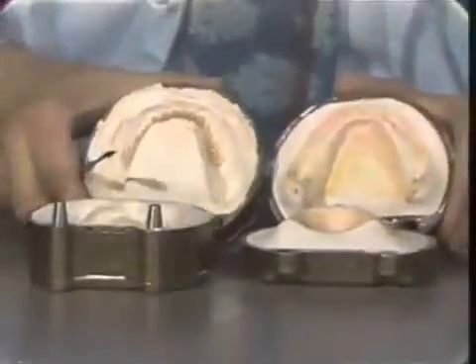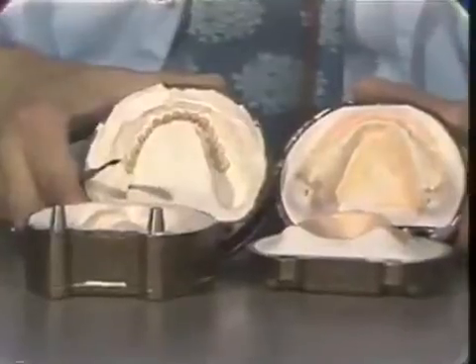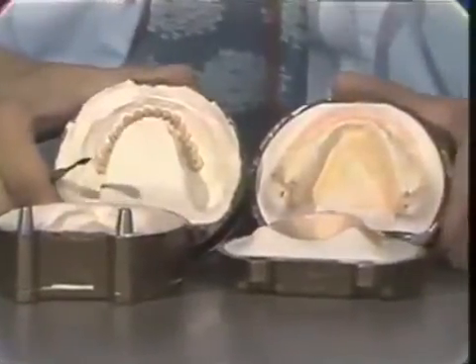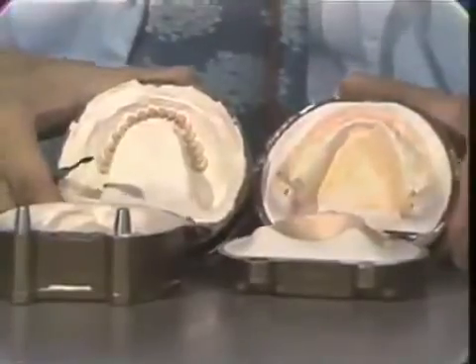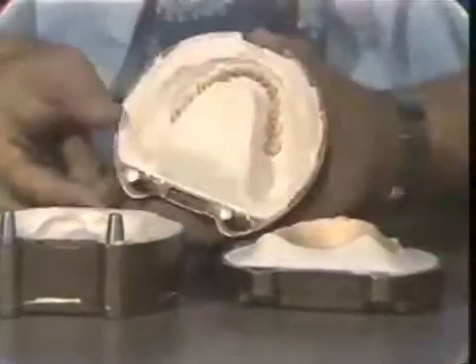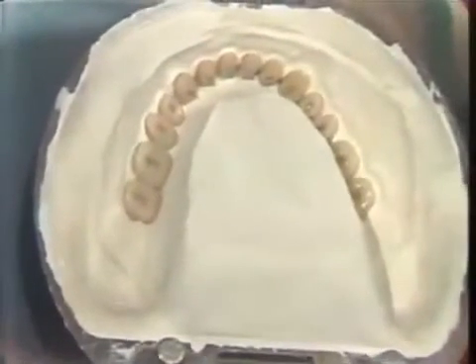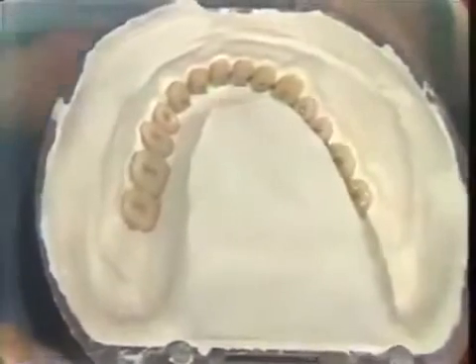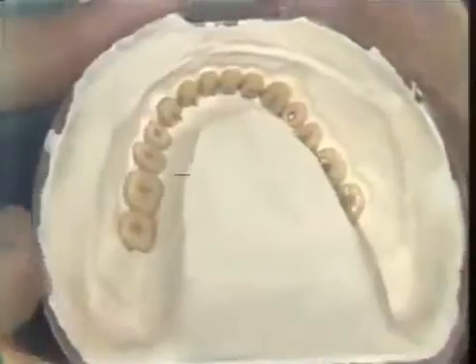Now you may see the mandibular flask. The master cast does not look any different than it did when you originally poured it. It has all the exact contours that you were so careful to preserve, and the top of the flask now contains the teeth. Again you can see the gingival contours. At this point we are done with the boil-out and we are ready to proceed with packing the denture.